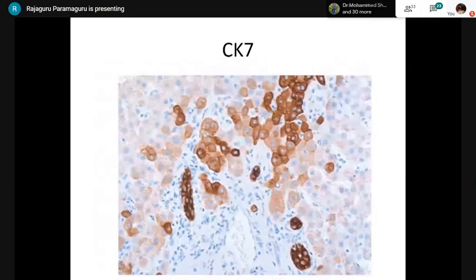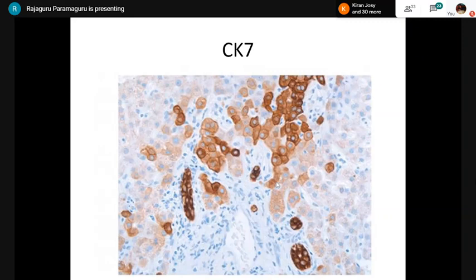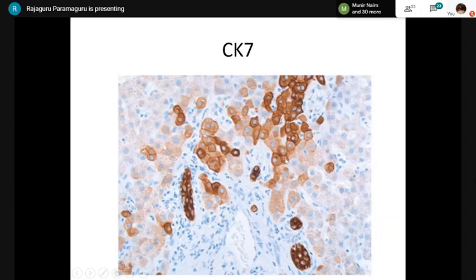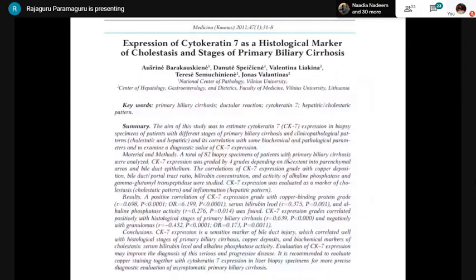CK7 is useful in chronic cholestasis: periportal hepatocytes stain positive for CK7 in secondary biliary cirrhosis due to immunophenotypic alteration in chronic cholestasis. You can see bile duct structures and periportal hepatocytes both staining positive for CK7. Studies have shown that the intensity of CK7 staining increases with advancing stage of primary biliary cholangitis, with the highest staining in the later stages — and in cirrhosis, the whole nodule may stain with CK7.